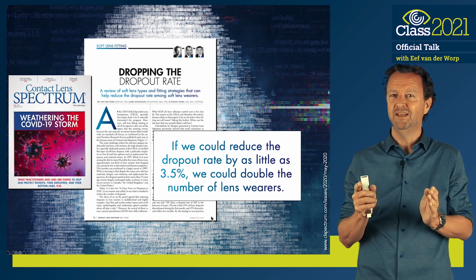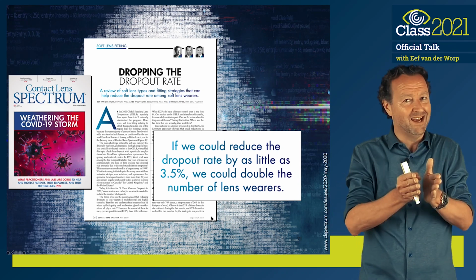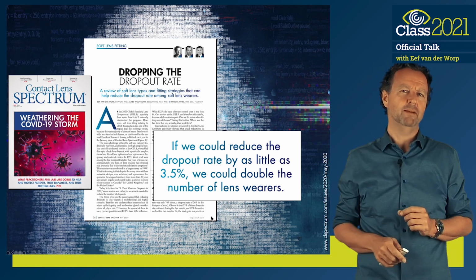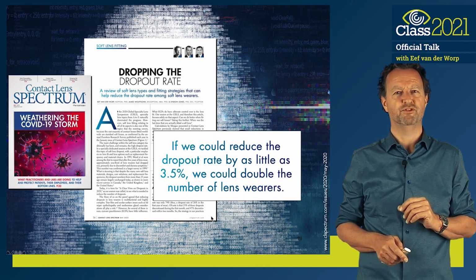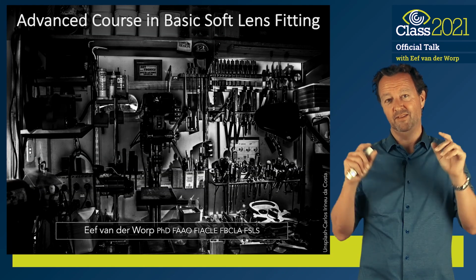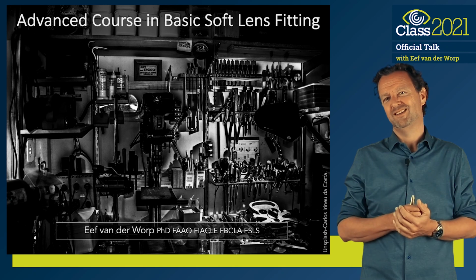Isn't that amazing? And I think, and we think, the team at Pacific, by just looking at lens design, and I know it's way more complex than just that, but let's just single that one out, we should be able to do better and maybe reduce the dropout rate by 3-4% just based on lens fit. So that is the hope, and that is the message that I wanted to give in this workshop, on an advanced course for sure, on something that seems very basic.